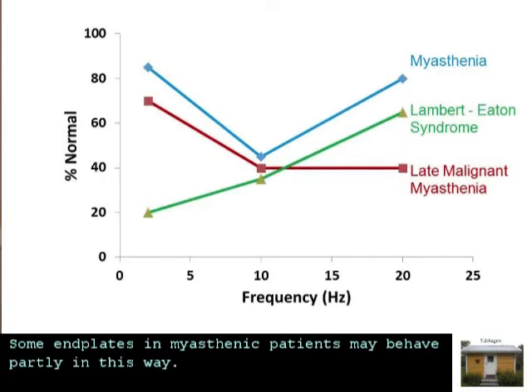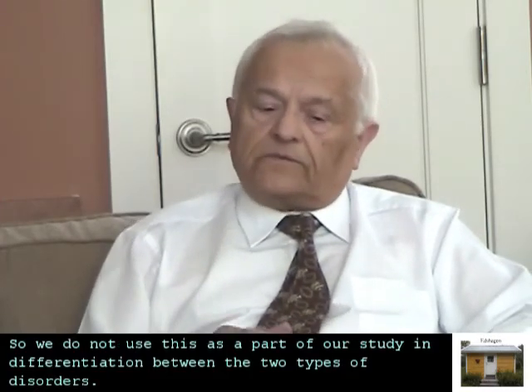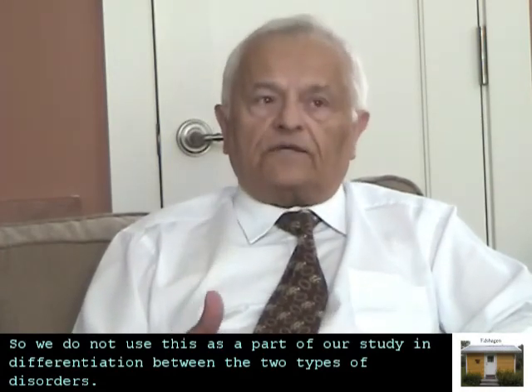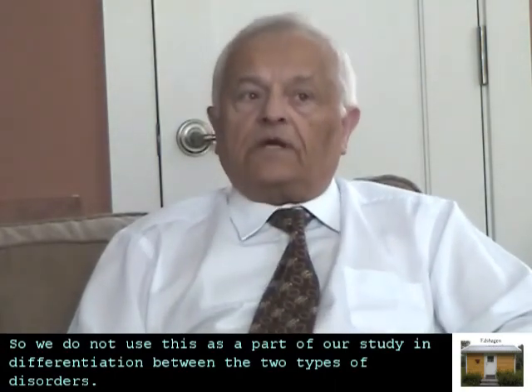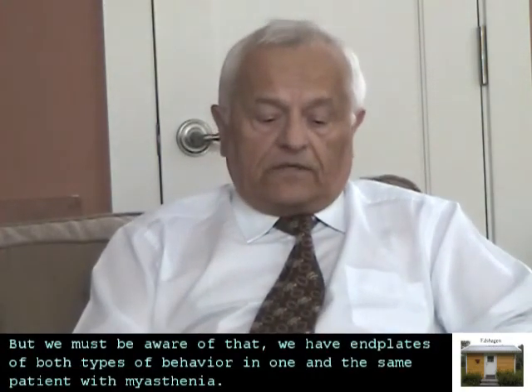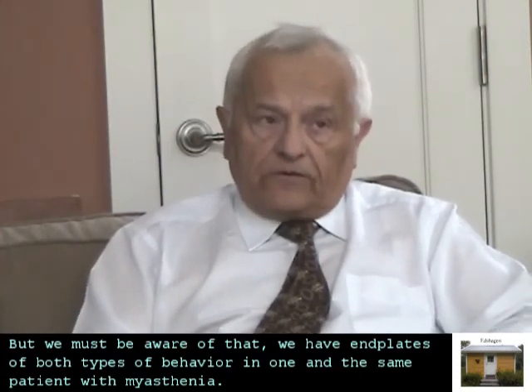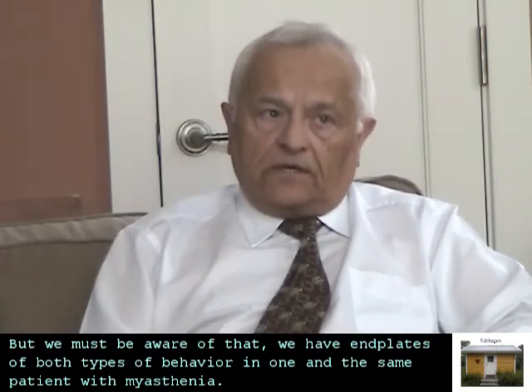And some end plates in myasthenic patients may behave partly in this way. So we do not use this as a part of our study in differentiation between the two types of disorder. But we must be aware that we have end plates with both types of behavior in one and the same patient with myasthenia.